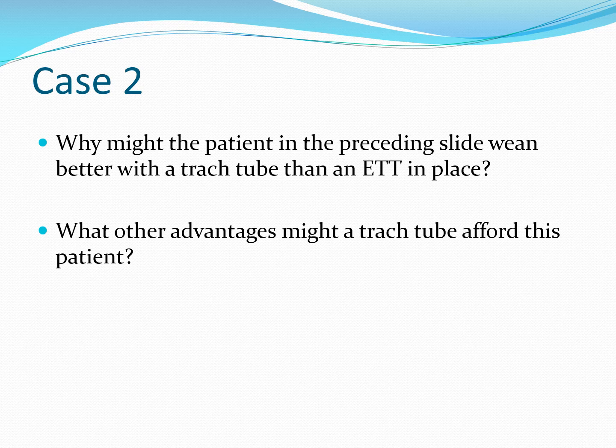They perhaps can participate. You explain to them, listen, we're going to be turning down your pressure support. Pressure support is the boost that the ventilator gives you. They'll better be able to participate in the weaning process. So it has to do with the resistance that's imposed on the patient by the artificial airway, with less resistance being imposed by a trach tube versus an endotracheal tube. But it has to do with some other factors as well.